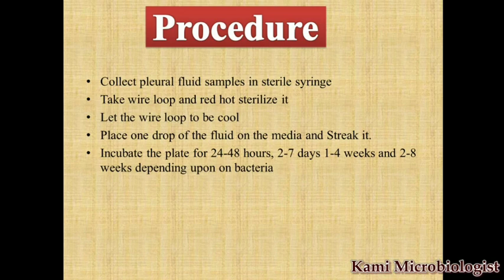If you are isolating, let's suppose, Legionella, you have to keep the plate for 2 to 7 days. And if you are isolating Brucella, you have to keep the plate for 1 to 4 weeks. And if you are isolating TB, the incubation period is 2 to 8 weeks.